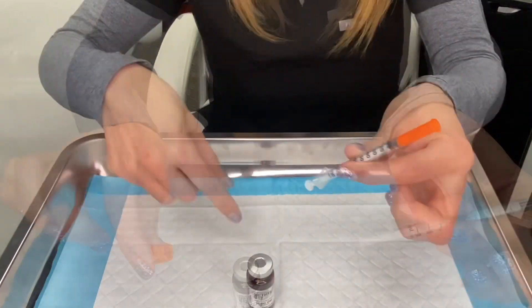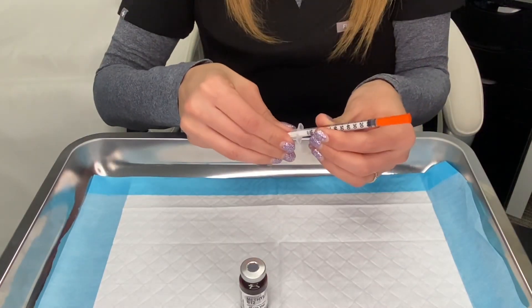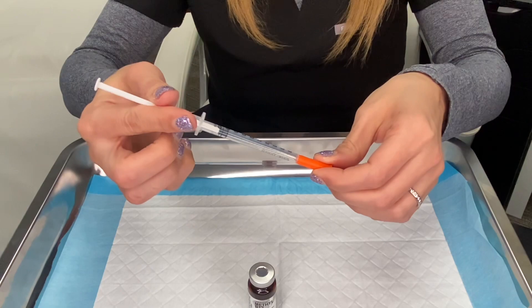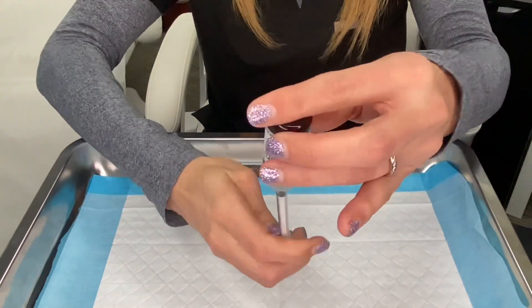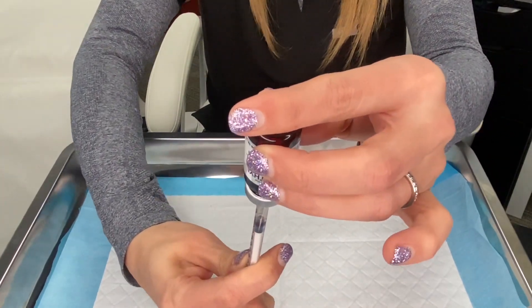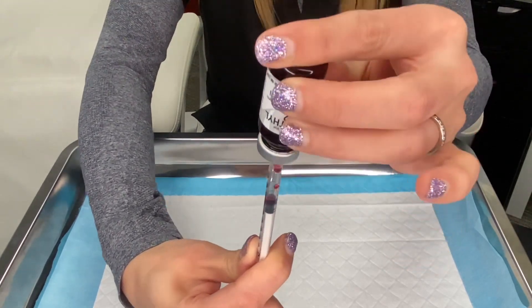Let's draw up a dose of vitamin B12. Take the stopper off the end of your syringe — you won't be replacing that. Then draw up some air into your syringe by pulling back on the plunger. You're going to be injecting air into your vial to make the B12 flow easier and more quickly into your syringe.